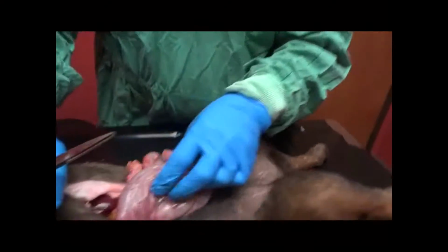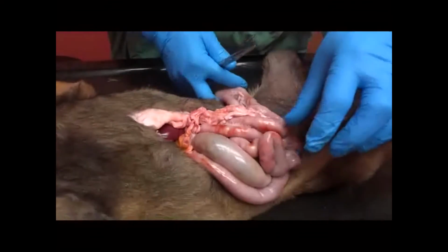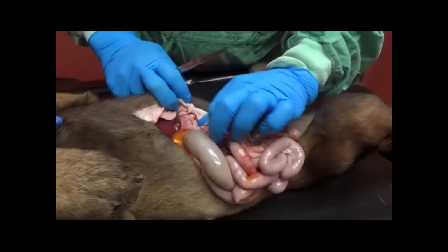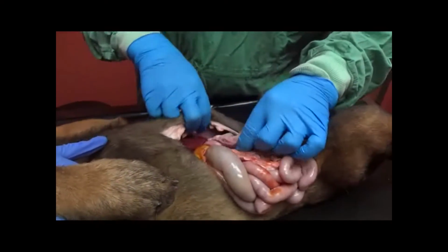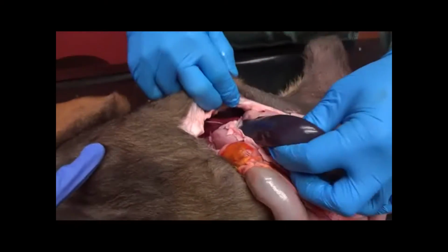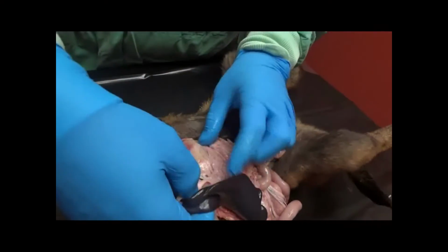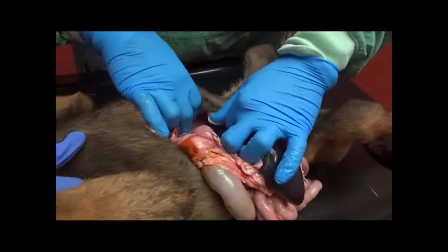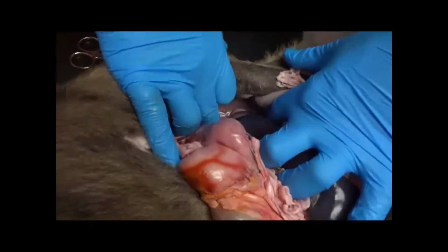We're not going to go into any viscera if we don't have to, since we've got a lot of post-mortem autolysis, and that would be something that would clear the room potentially. So we can go over here and visualize some. There's the spleen with appropriate omentum around it. Down here is the left kidney. You might be able to see that. See, normal.